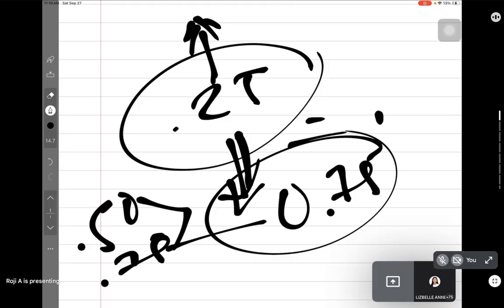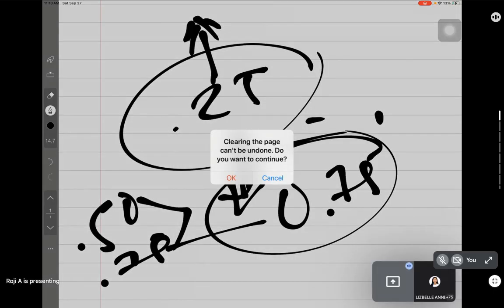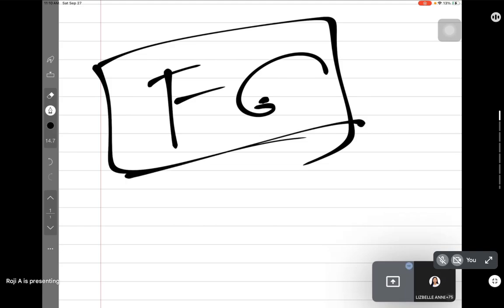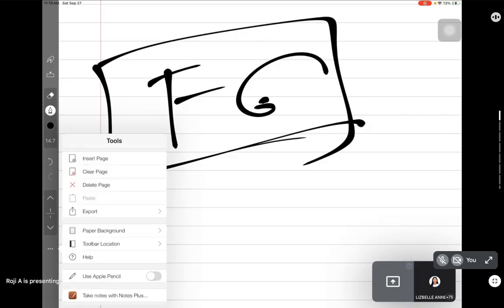Not to mention, these things that we're doing in actuality are something you don't need to do, because every manufacturer will come up with a guideline. Their fitting guide is already a way to make it easier for practitioners to order even without going through the computations. So moving forward, you know that this is something you need to compute for the board exam specifically, because you need to be computing. Unless you'll be computing in your practice, you can also do that.